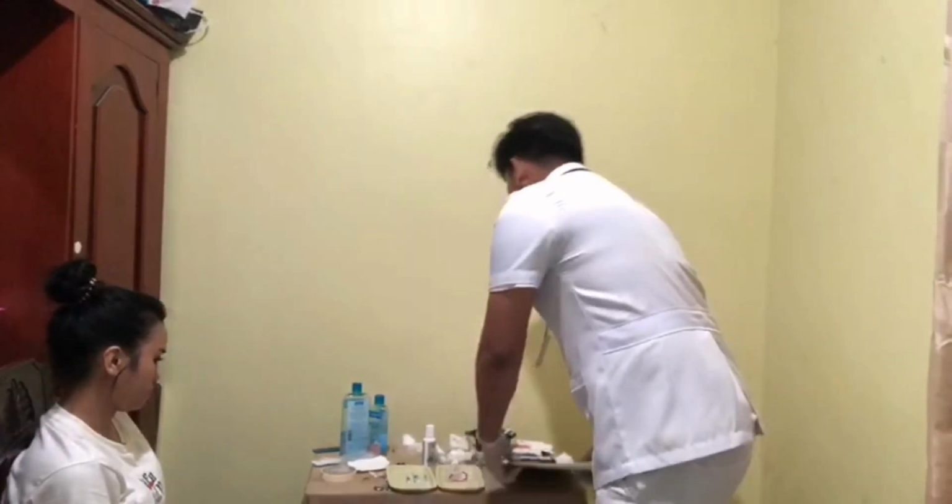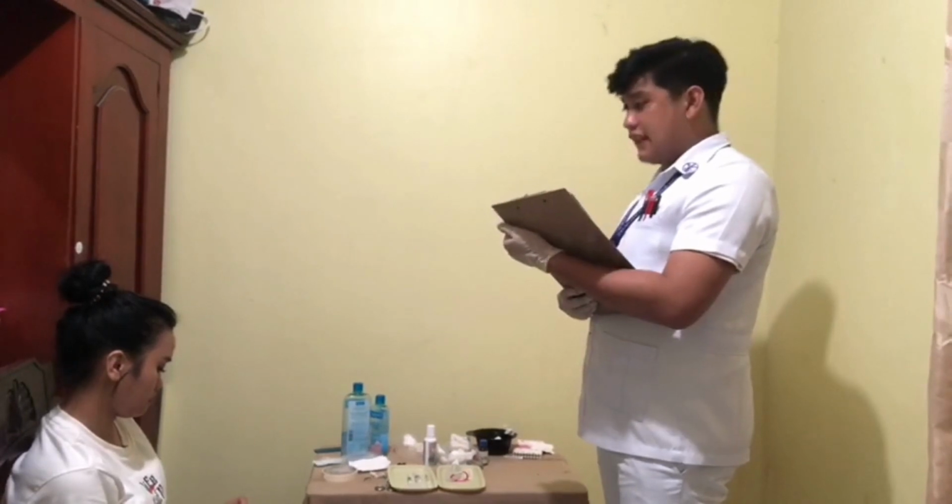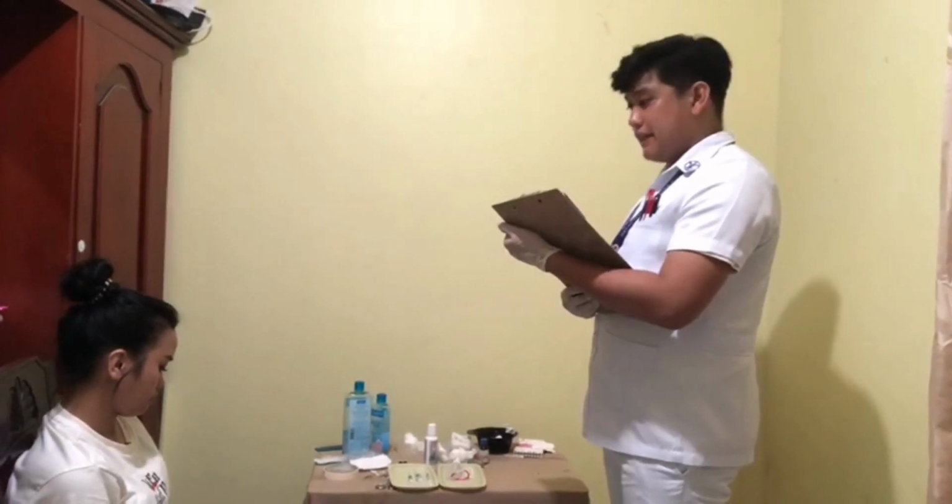So hello ma'am, I am Charles Saxel-Hasta, your student nurse for today. Dr. Yoon has ordered a penicillin skin test, which means I have to inject just a small amount of penicillin in your skin to check if you have allergies to the penicillin medication.